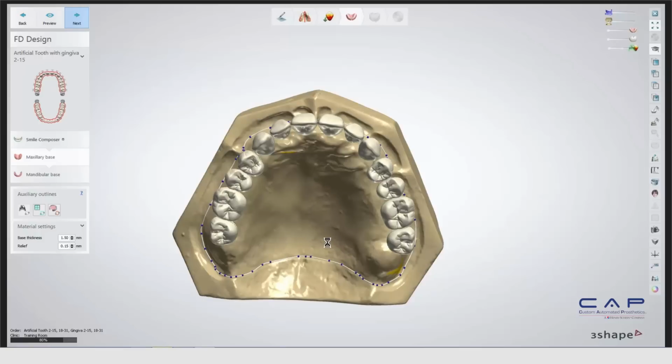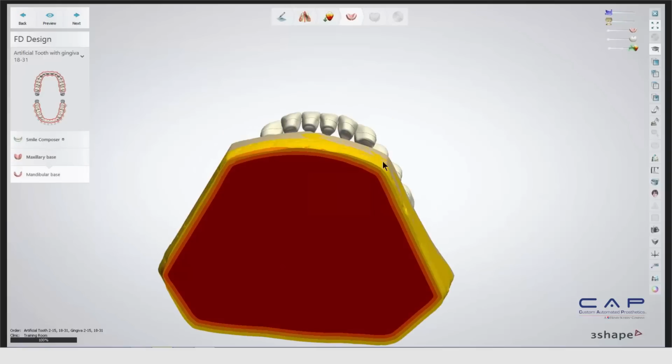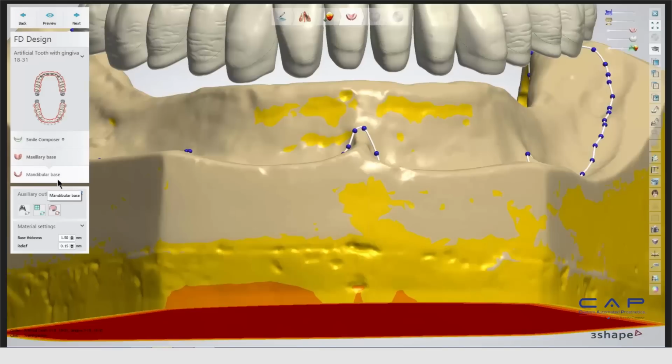Now the good thing about this is it's a little bit more adaptive, because if you take a look at the teeth that we see on here, I'll rotate it around, but you'll see there's kind of like a green spline around the bottom of the teeth, and that's where it's going to tell the gingiva to kind of snap to that anatomy portion. So it's a little bit more intuitive of a pre-design. Unfortunately, it won't let us do that until the next stage, though, because it doesn't do the sculpt.